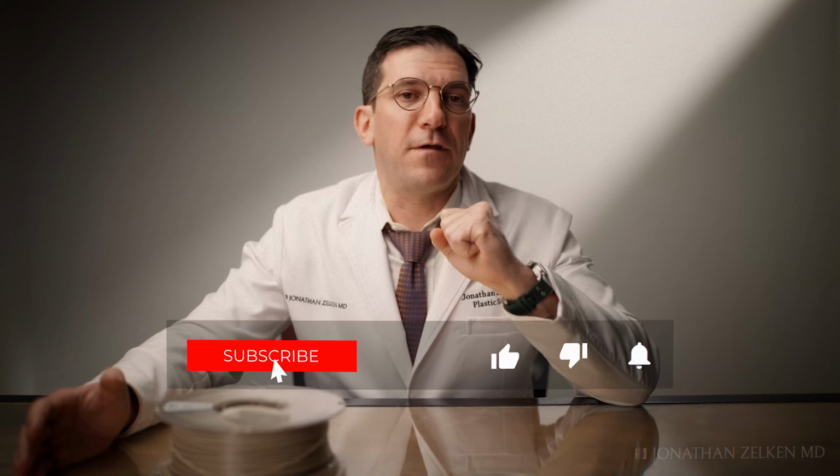So PEEK versus PEKK, both are cousins, both belong to the polyaryl ether ketone, or PAEK family, and both of them are commercially available for use as a craniofacial implant or an onlay cosmetic implant, as I would most likely use them for. If you have any other questions about PEEK versus PEKK, I'm not going to sit here and say which one's better. I have my thoughts, which could potentially be better, but both work so well that there's no reason to compare them. It's an issue of availability at this point. They are great options for facial implants.